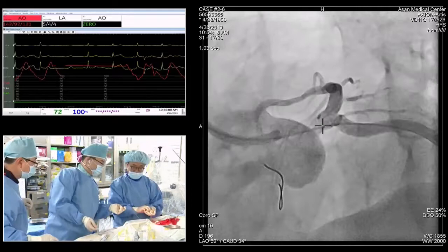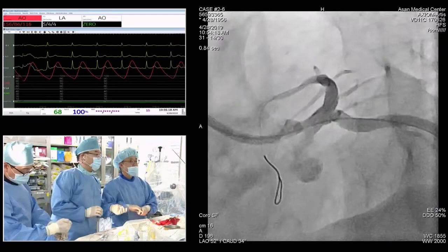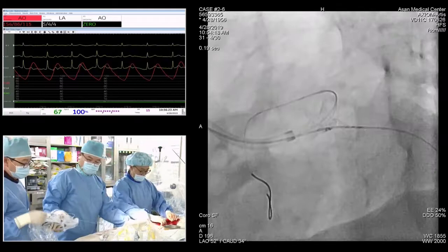Greg, I think it looks beautiful angiographically. The ostial circ always looks a little bit underdone, but with your 4.0 balloon it's probably going to be fine. It would be great to see an IVUS, particularly of the ostial circ. There are two recent studies worth noting. A randomized trial from China, 336 patients, of IVUS versus angio-guided left main stenting. Mortality at 1 year was 6% in the angio group and 2% in the IVUS group.